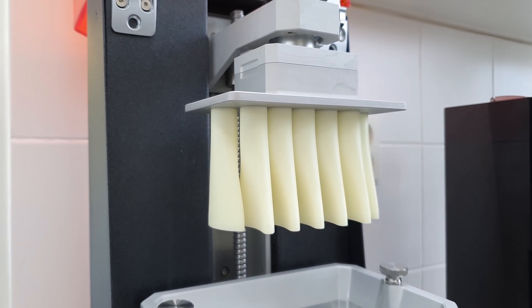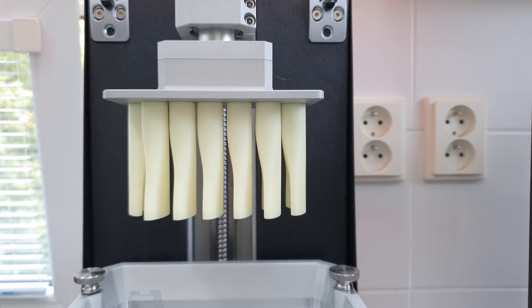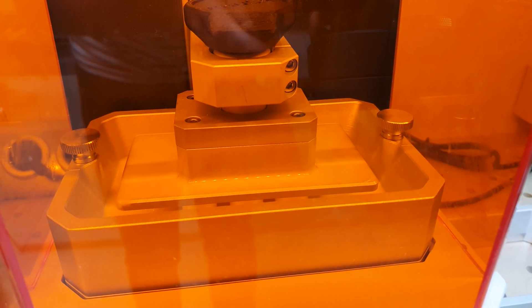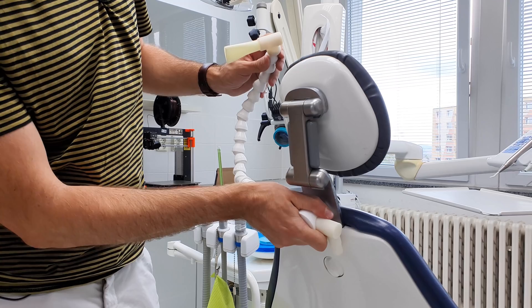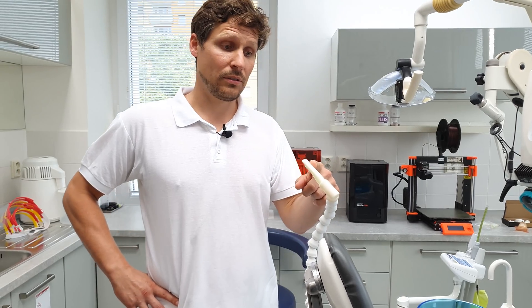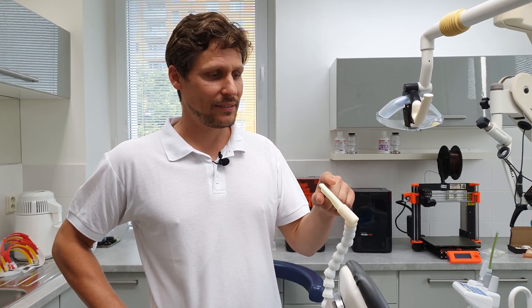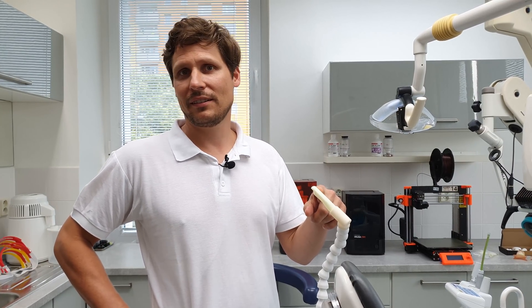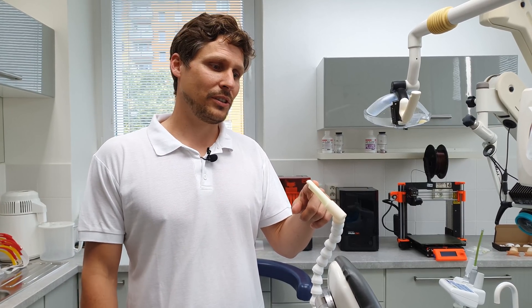Here you can see how the suction heads are being printed. We print without supports, so that's something we need to keep in mind when designing the models. However, an object that requires no supports can save you a lot of time during the actual production process, so it's definitely worth it. As a doctor, I truly appreciate this suction head. It's a great tool which can be produced quite quickly. This is very useful because we are required to dispose of every suction head immediately after use and replace it with a new one. It's great how quickly we can fine-tune the design — I can just ask Lukáš to adjust the shape and he can do it right away.